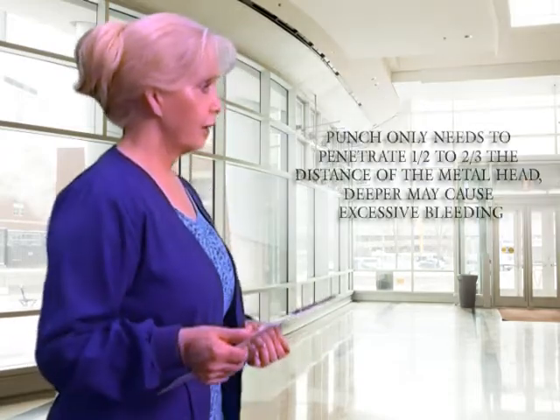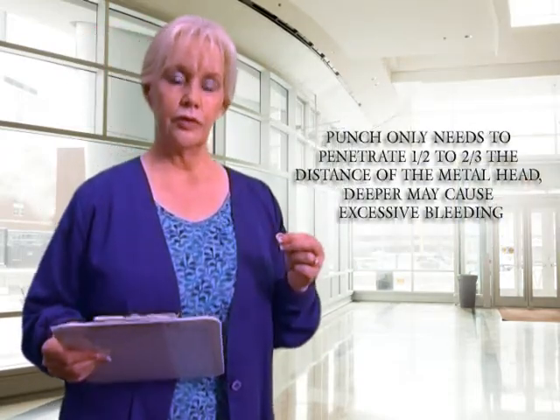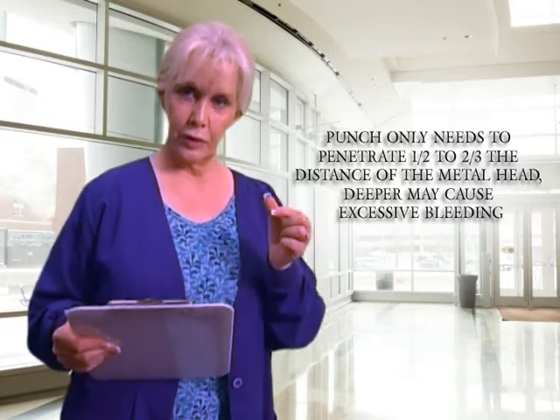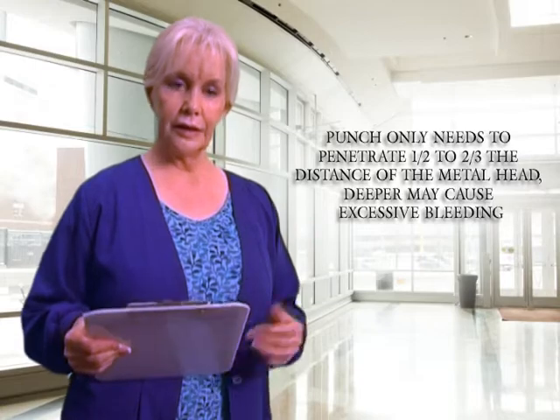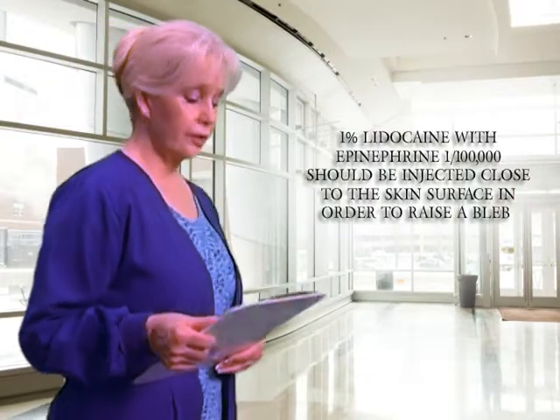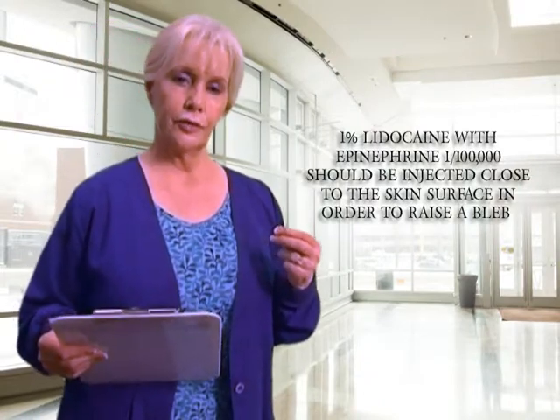In conclusion, I'd like to leave you with a couple of very important pearls to remember. First, when you're performing the punch biopsy, you only need to penetrate about a third to two-thirds of the metal part of the punch. Any deeper and you can cause excessive bleeding.